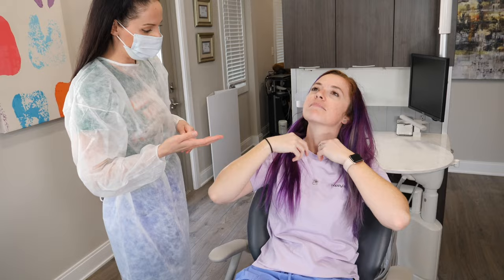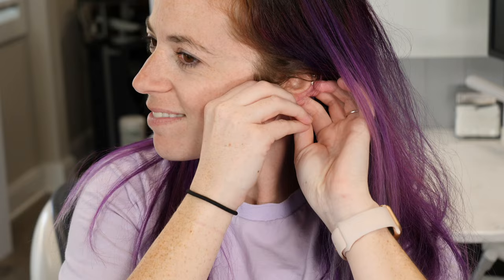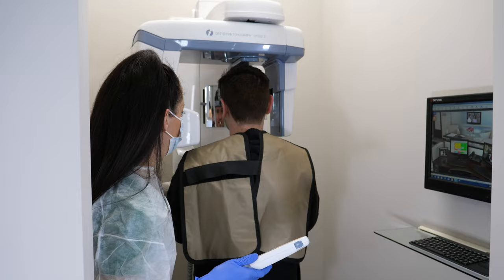The only thing you have to do is what we said earlier — make sure you're not wearing any metal from your neck up. Every machine is a little different, so listen carefully to the instructions that your dental provider will give you.